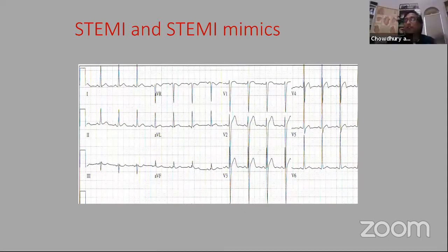So before the faculty answers, let me answer you first. If this is an oral exam and the student says by looking at the EKG that there is ST elevation MI, then I will give him a second chance. I will request him to explain more about what he is up to. Because the ST elevation part I understand, I will ask him, what are the other causes of ST elevation? And do you think that another cause of ST elevation is associated with LVH? I expect that the student should recognize that ST elevation can be associated with LVH.